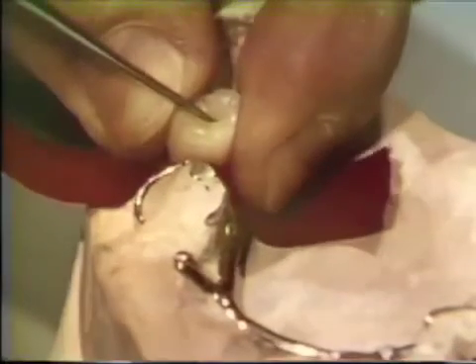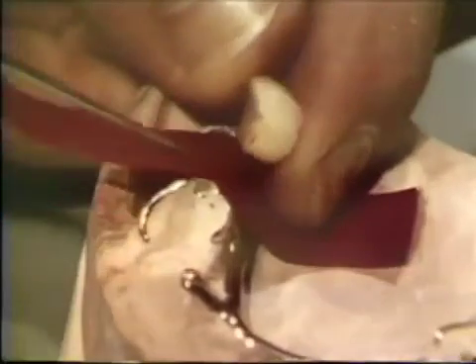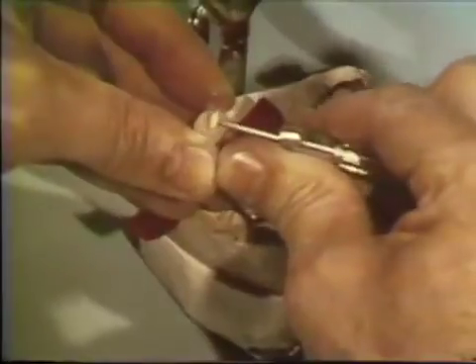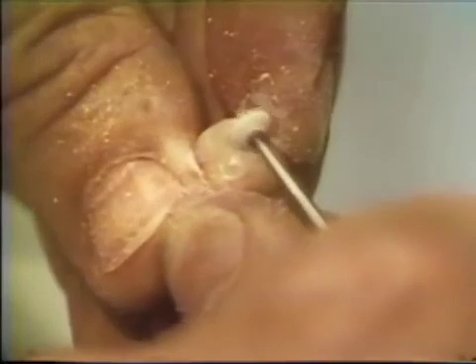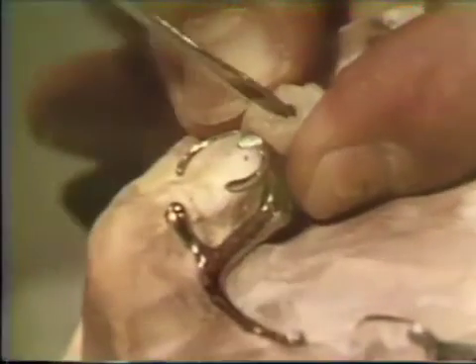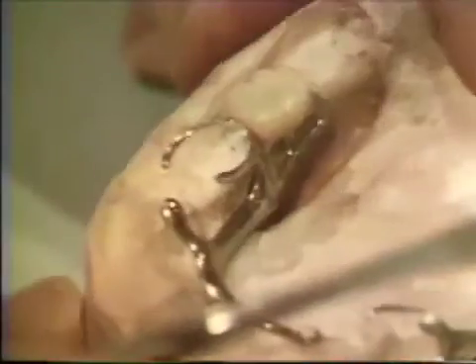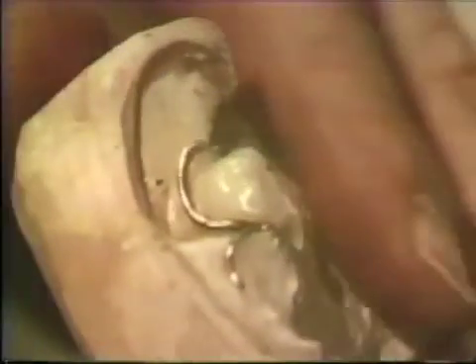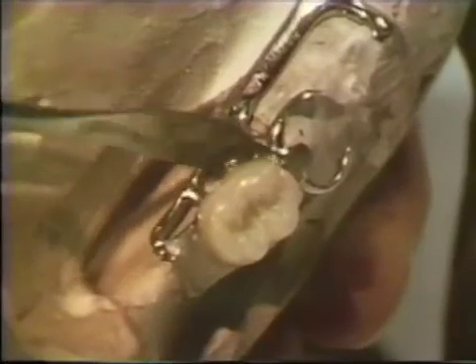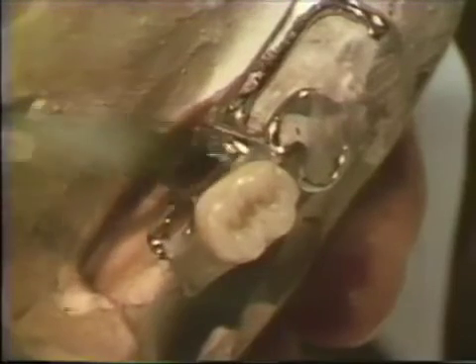Using an articulating ribbon, the replacement tooth is marked on its inferior and proximal surface so that it can be adjusted and properly fitted to the residual ridge and to the partial denture framework. The replacement tooth is arbitrarily located in its buccal-lingual relationship to the underlying edentulous ridge and is adjusted to proper anterior-posterior position. When this adjustment has been achieved, the replacement tooth is firmly waxed into position.